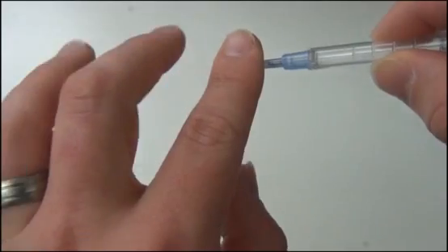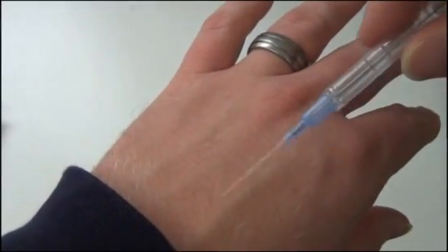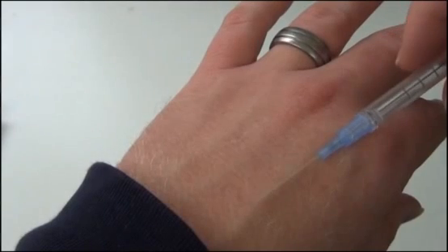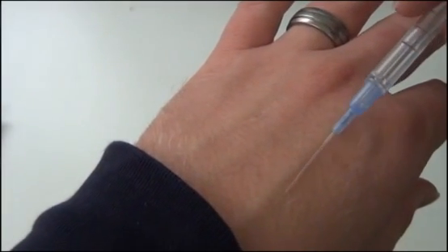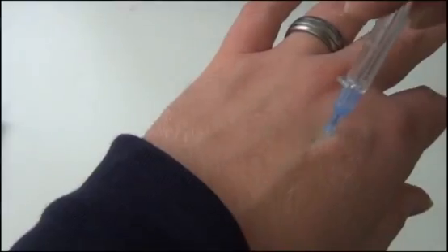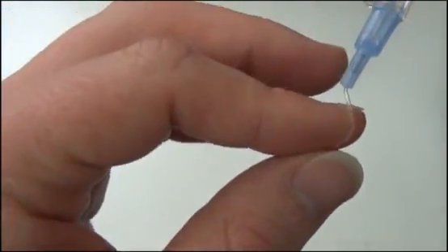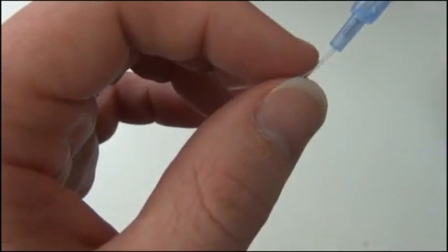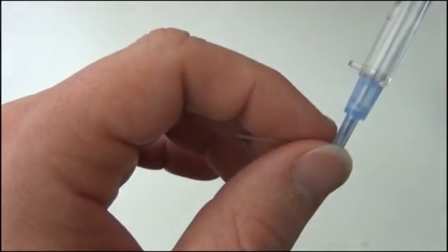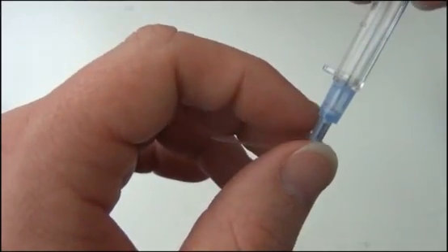So this will all be under the skin. This will all be inside right here. So that would maybe look like that, but the whole catheter obviously is going to be inside that vein. So you release the tourniquet, and then you can kind of bend this up a little bit. What that does is it kinks that off. These are pretty durable, but you'll want to be careful not to obviously break it, but you can kink it up a little bit, and that's to keep the skin and everything clean once you take this off.